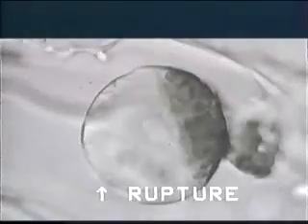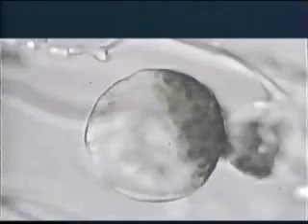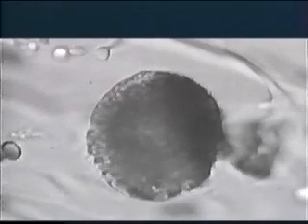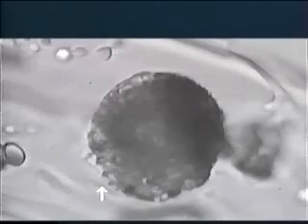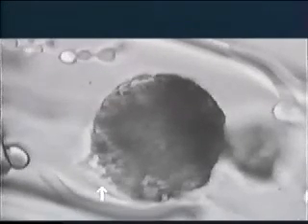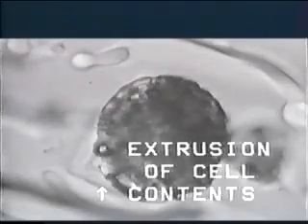The same event with another cell shows rapid cooling of the extracellular environment. This rapid freeze extracts the water content of the cell so quickly that the membranous structure ruptures and bubbles of gaseous material push their way out of the system. Ice will continue to form and move in through the opening in the membrane, allowing the contents within the intracellular environment to become frozen. As warming begins, we observe the effect of thawing the cell.